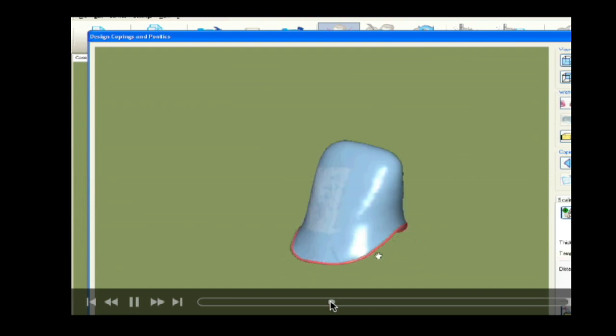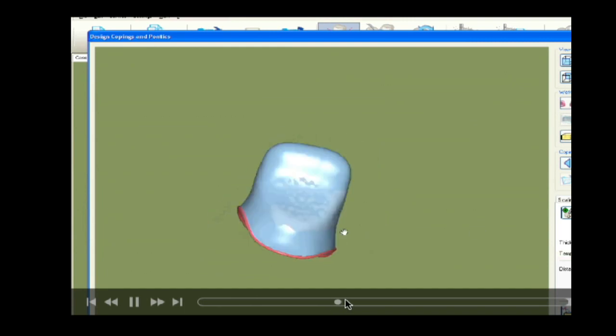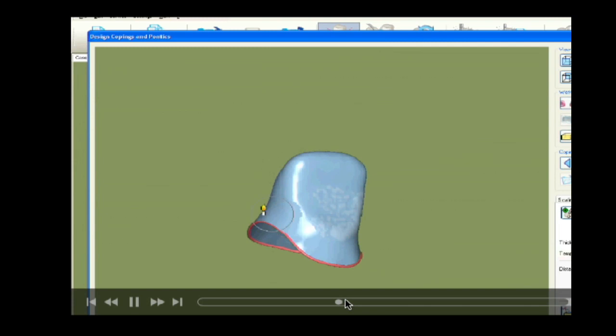Again, we see here how the technician is adding wax virtually on the die on the areas where we can have better support and better strength.